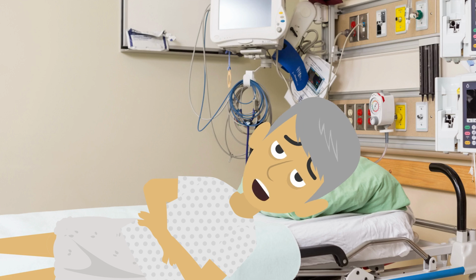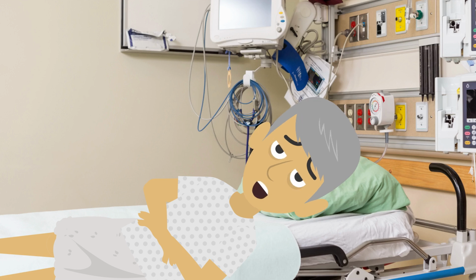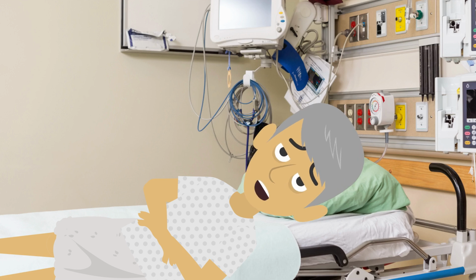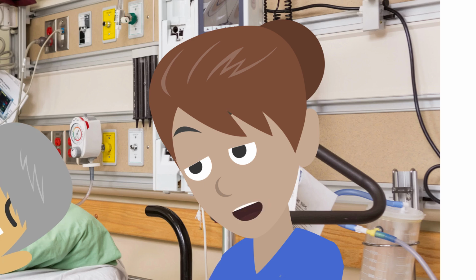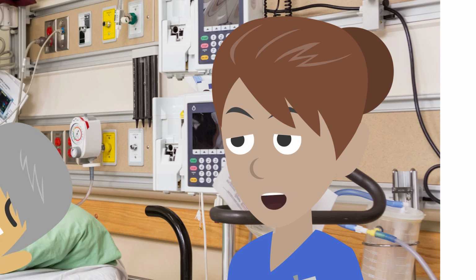Yes. I was told I'd have to have the tube put in. I've had difficulty swallowing and haven't been able to take in any food or drink through my mouth. Before I start, I'm just going to clean my hands. Okay. I'll explain the procedure now.